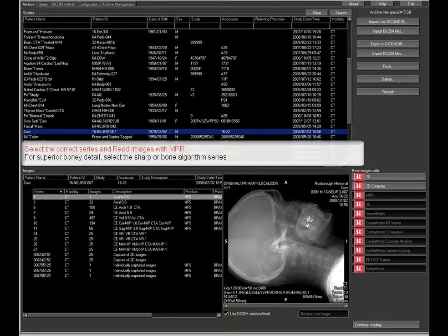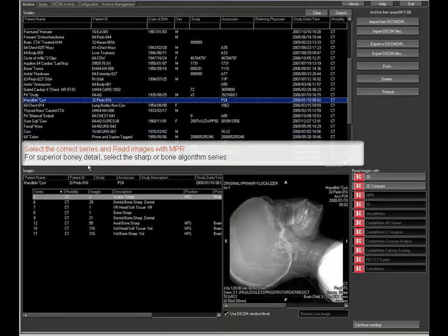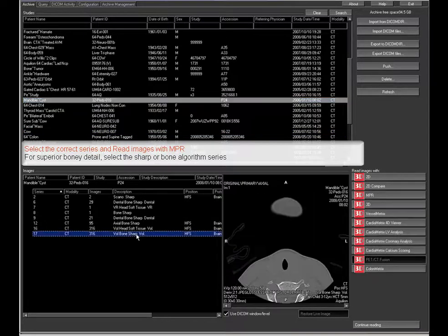From the study browser, select the series. For superior bony detail, choose a sharp or bone algorithm series.